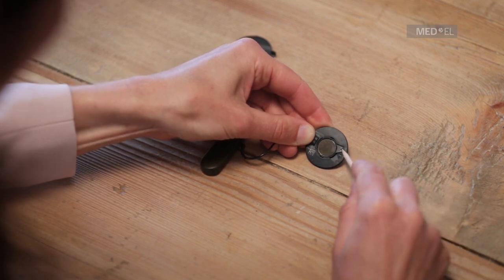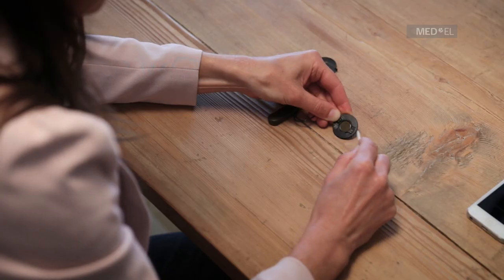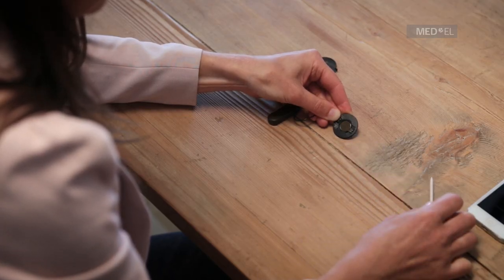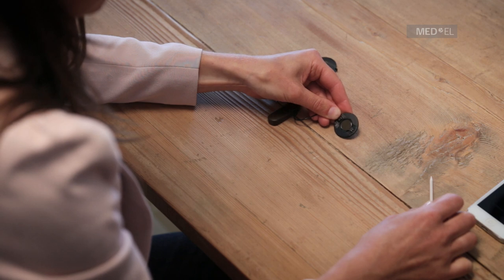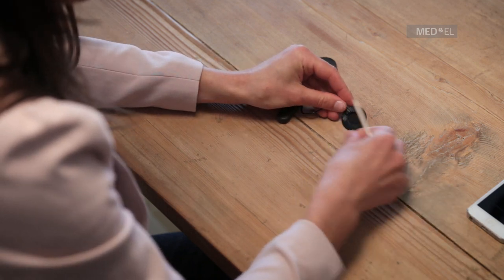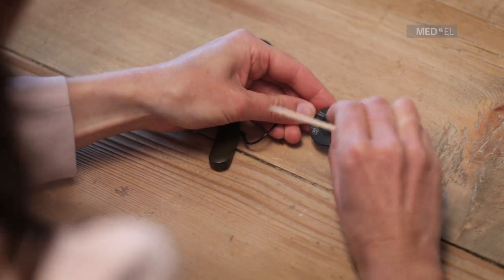To replace the magnet, your clinician should align the magnet to the center position, tilt the magnet out of the DL coil, and insert the desired magnet with the tab aligned to the center position.